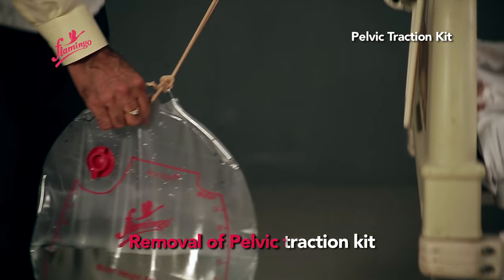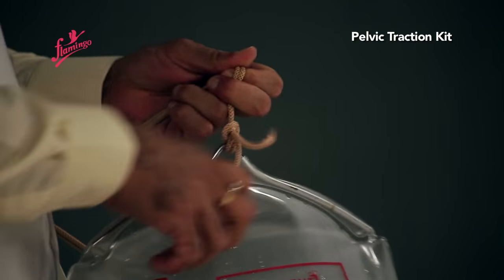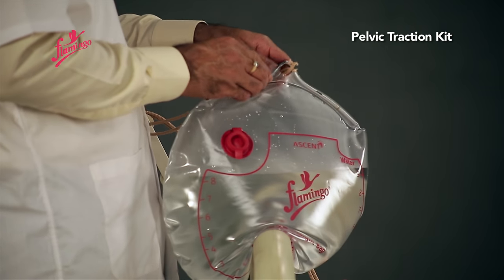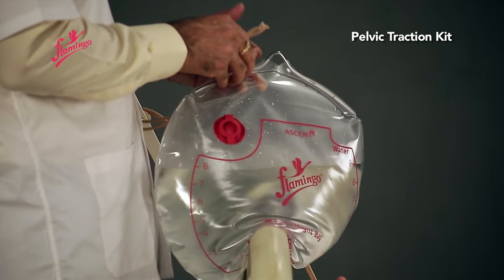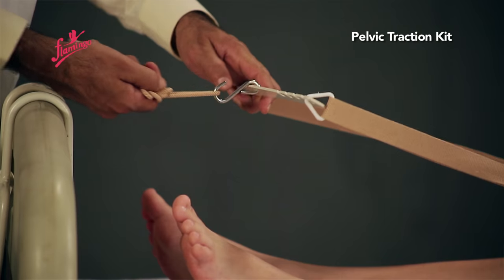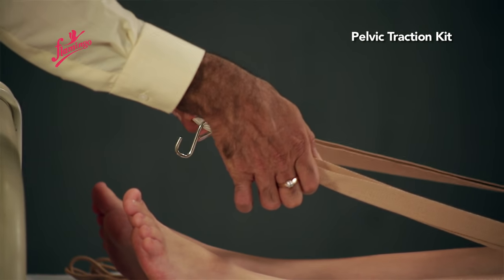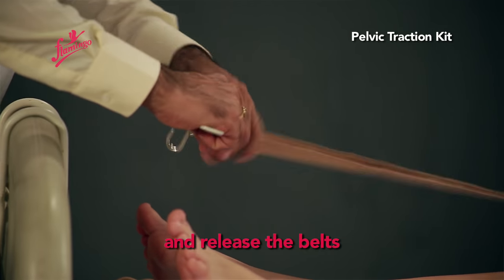Removal of Pelvic Traction Kit: Remove the weight bag, untie the traction cord from the spreader hook, and release the belts.